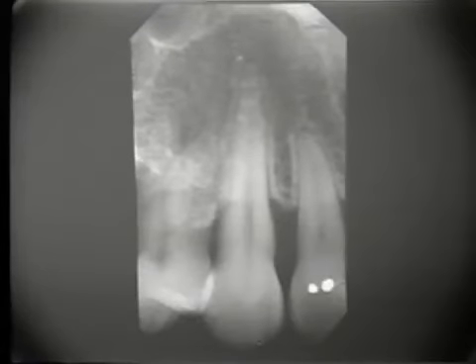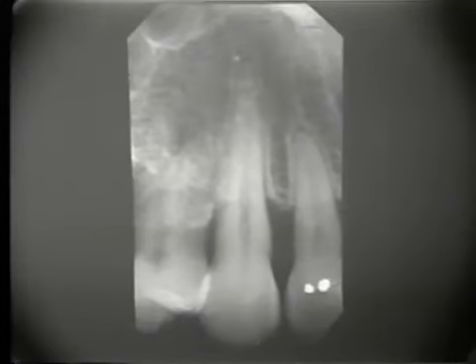Now we turn to the maxillary right cuspid region. On this film, we will endeavor to locate the image in the center of the film, and we will strive to open the mesial contact of the cuspid, thus showing the distal surface of the lateral. The distal surface of the cuspid is overlapped with the bicuspid, but that contact will be opened on the following radiograph.